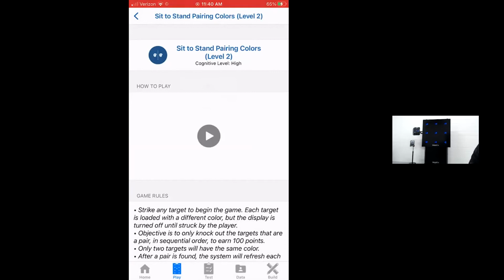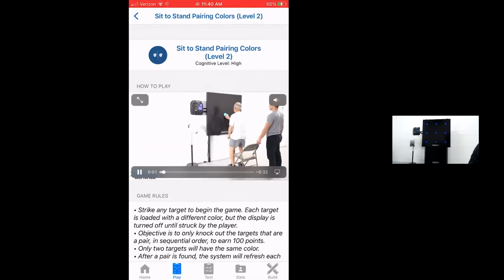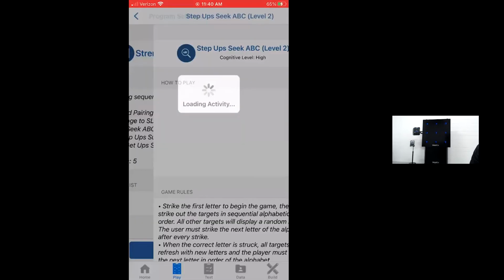You'll be able to generate a PDF report, see how you're doing, see the progress over time. Are we also getting better on these programs too? And if that's the case, great, and then we ran these programs for 3 to 4 weeks, and then retest against the baselines. So you can see we're doing a sit to stand, again, lower extremity strength, okay? And we're just developing that component, but also always doing the dual task component as well. So you're just seeing a few ways you can do that.